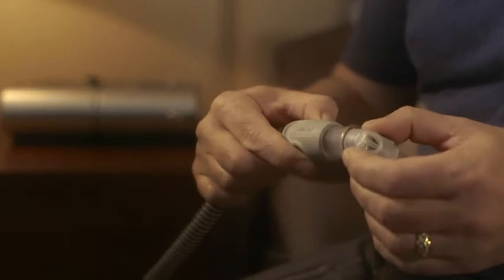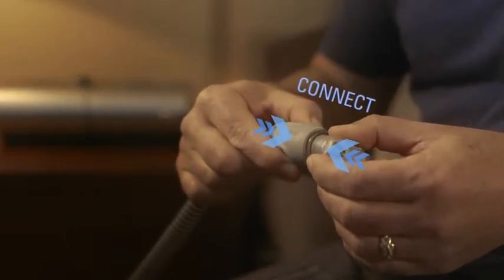Connect the air tubing from your machine to the elbow of your mask. Then attach the elbow into your mask by pressing the side buttons and squeezing the elbow in.